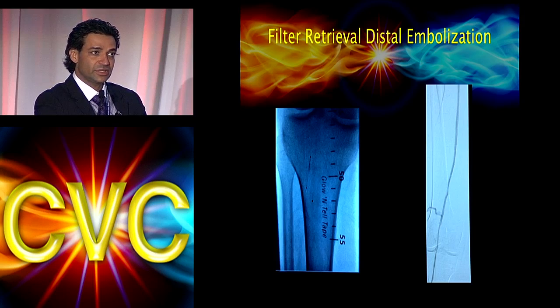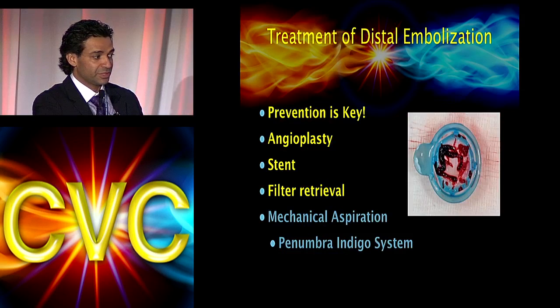The problem with this is you can push that debris even further. And that's where you run into a problem, if you then send it even further downstream, down into the pedal arteries, then that's even a bigger issue.